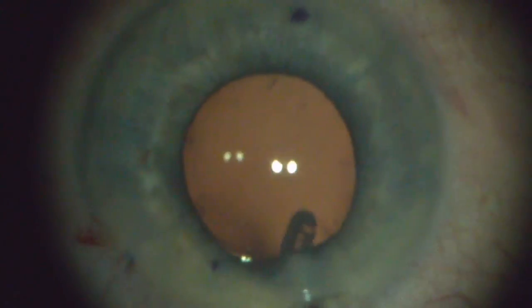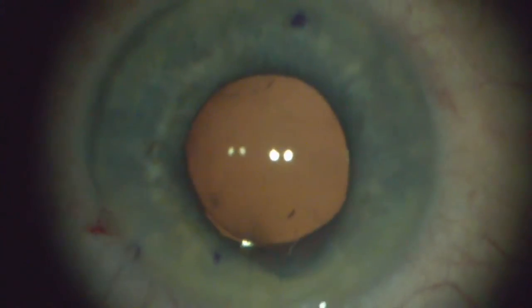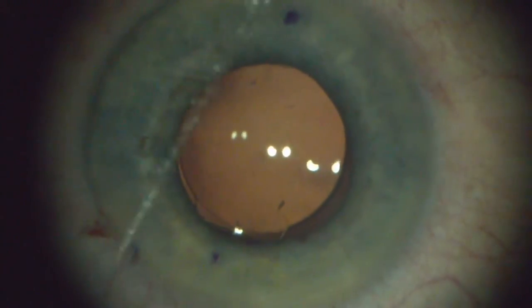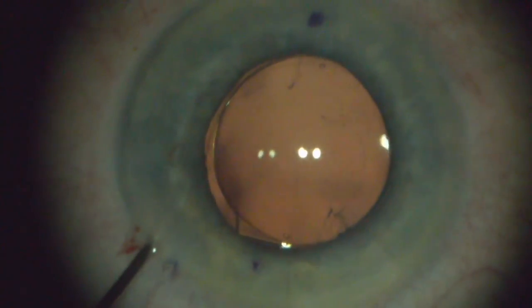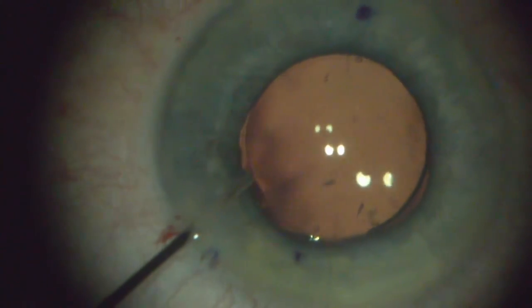I will do a final reading with Aura. In this particular lens, with a CrystalLens or a TrueLine, you want to make sure that the wound seals very nicely. I put a suture in just because it allows me to sleep at night — I don't worry about my patient rubbing their eye. Even though I can do a self-sealing incision on these, I still put a suture in and I remove it at one week.